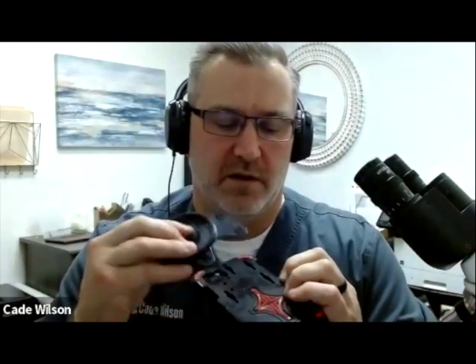Your case can be an everyday phone case. It comes with this and a little disc, and the disc just pops in. I'm trying to do this backwards here. It just snaps in here, and so it lines up the camera. I'm just trying to get the pictures right that we want to utilize.